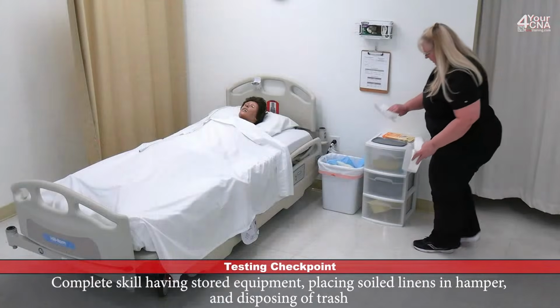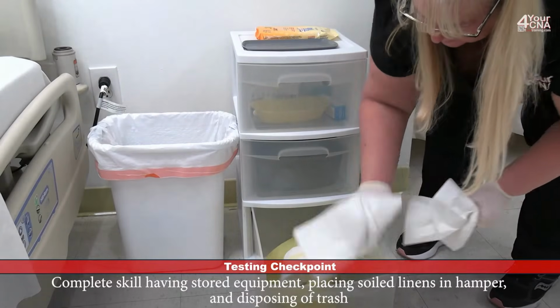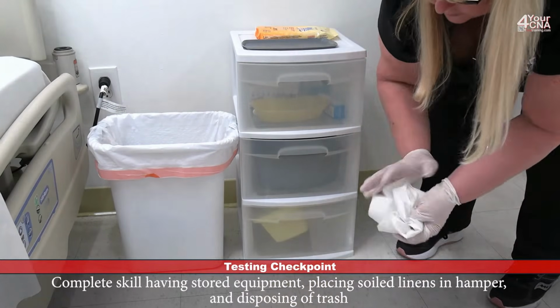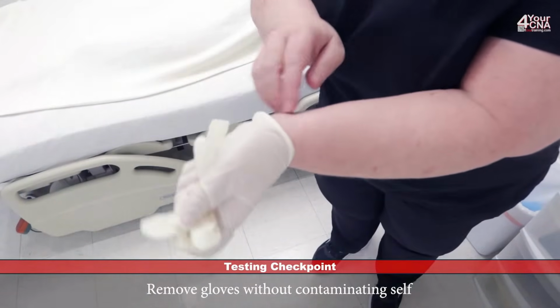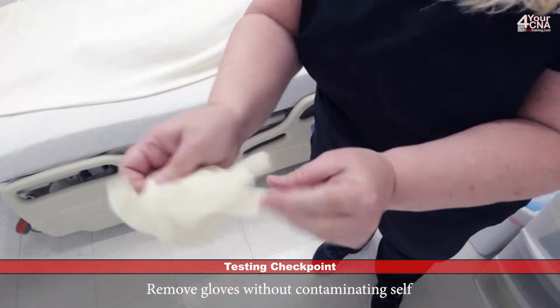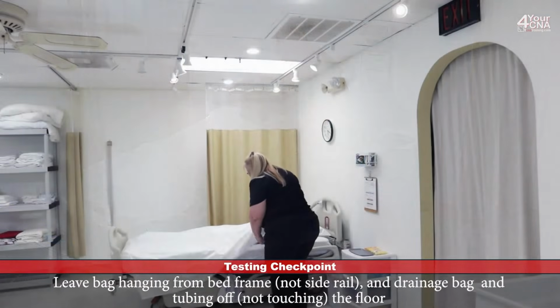Okay, Miss Jones, I'm just going to return this to storage using a paper towel to open the drawer. And closing the drawer, we'll throw those paper towels away, and then I can remove my gloves. I'll take a peek at your tubing just one last time.